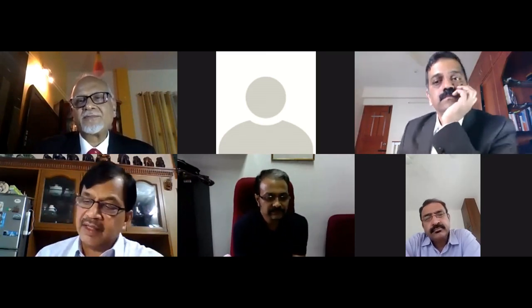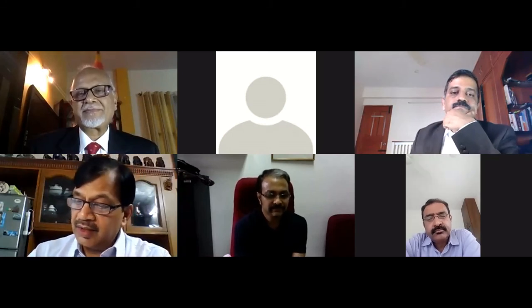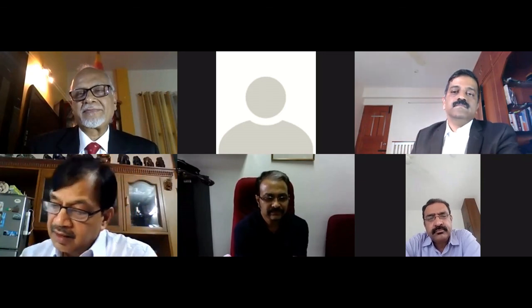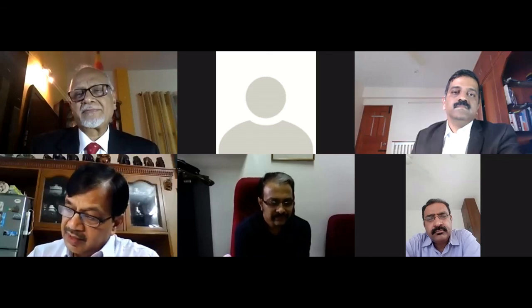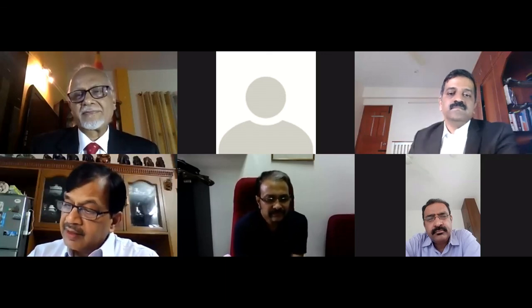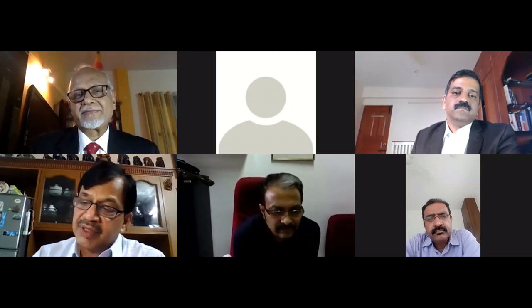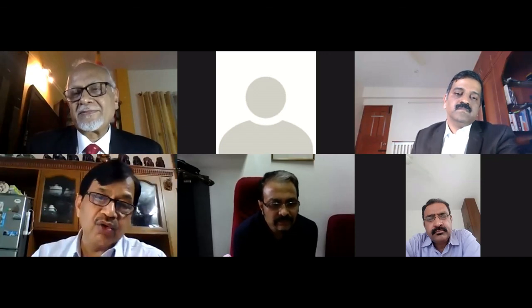Thank you, Ullas. I think we are overshooting the time. I have two questions quickly. One is to you, from Dr. Sadat Hussain, and Dr. Chawla has asked a question about a patient who has come with recurrent palpitation, and the ECG shows only ventricular bigeminy. How do you go ahead?